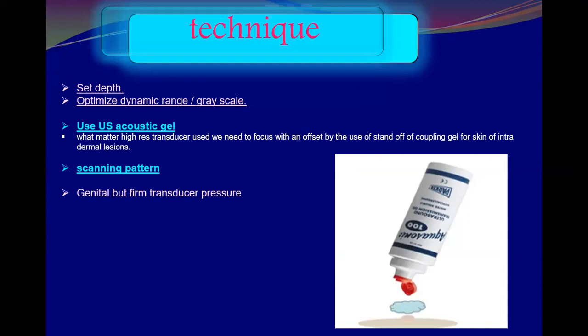Either clockwise or radial. Excellent. Clockwise or radial? Okay. So we have one technique, radial.